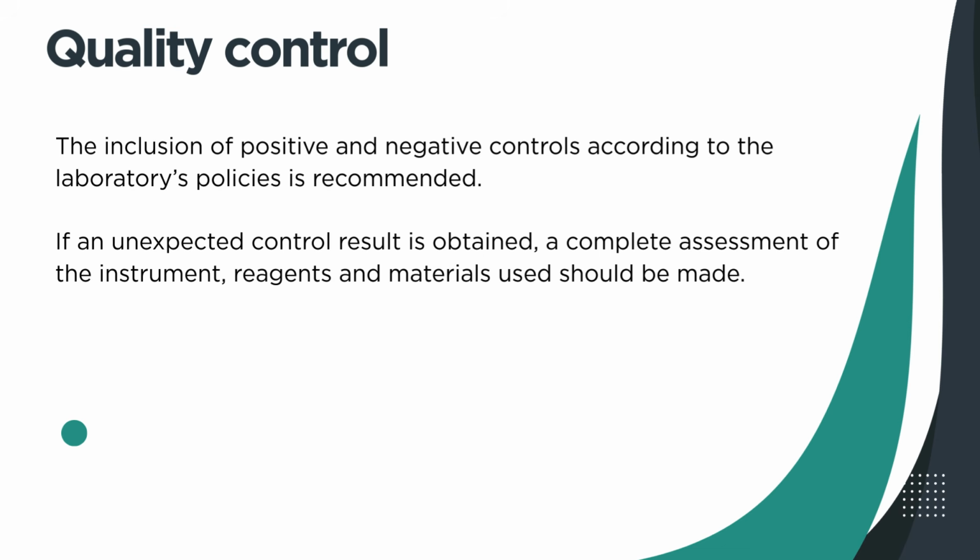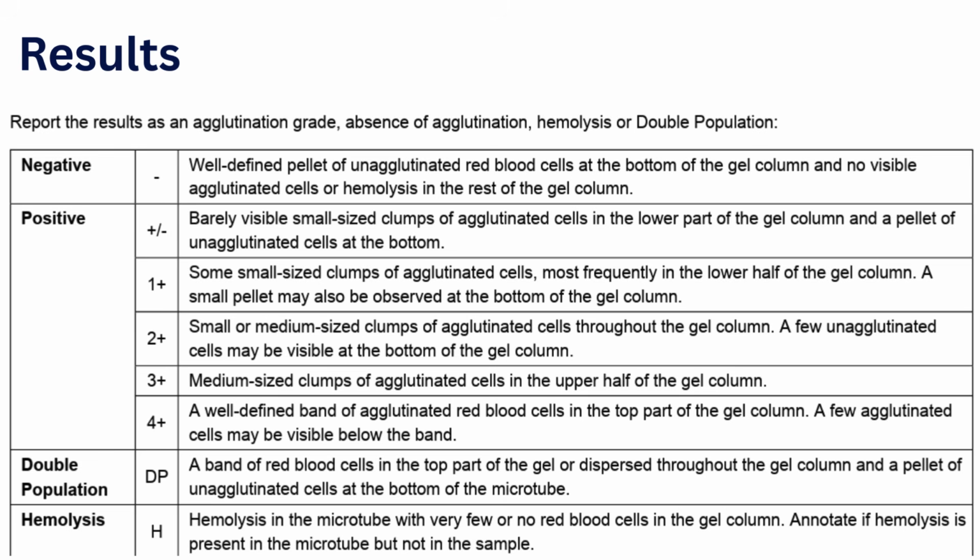For the QC, the inclusion of a positive and negative control according to the laboratory's policies is highly recommended. We need to have a positive and a negative control if you are performing this testing. If an unexpected control result is obtained, a complete assessment of the instrument, reagents, and materials should be done.